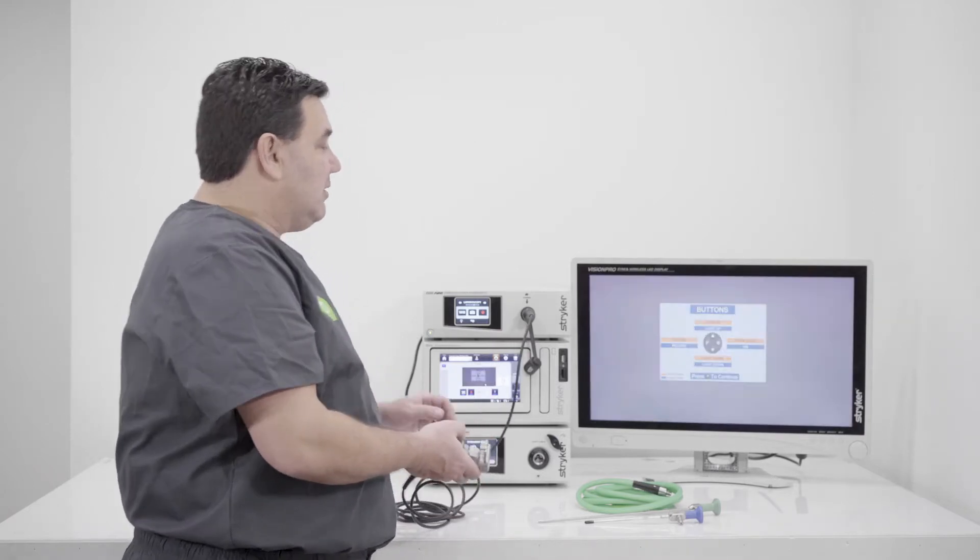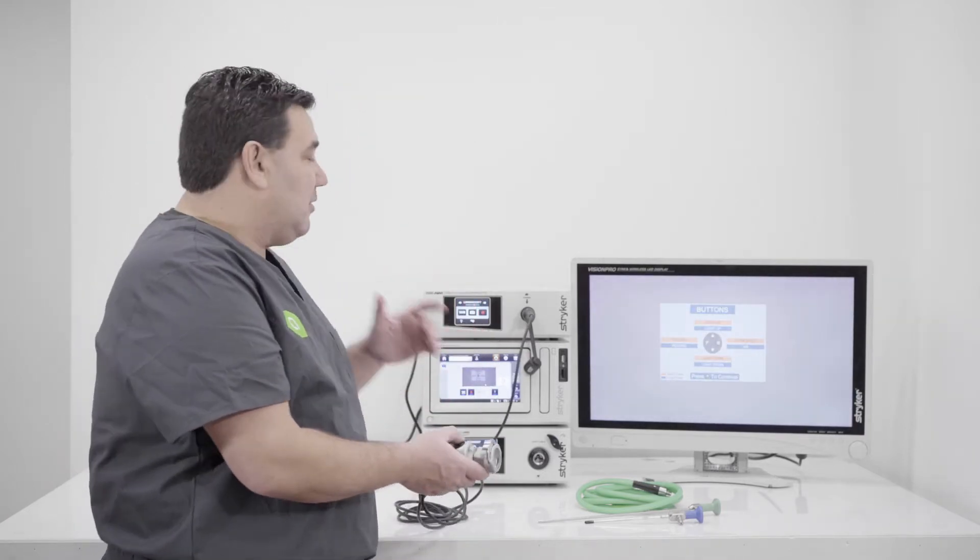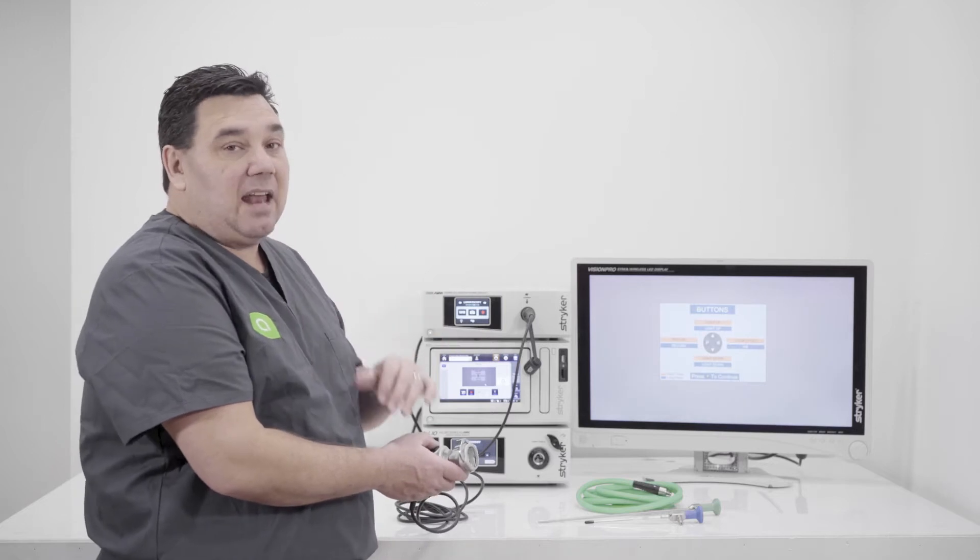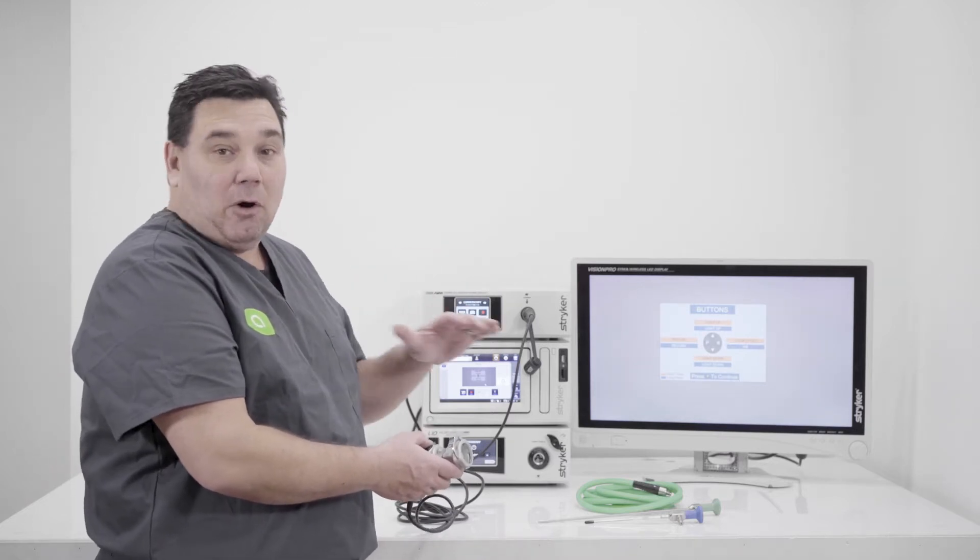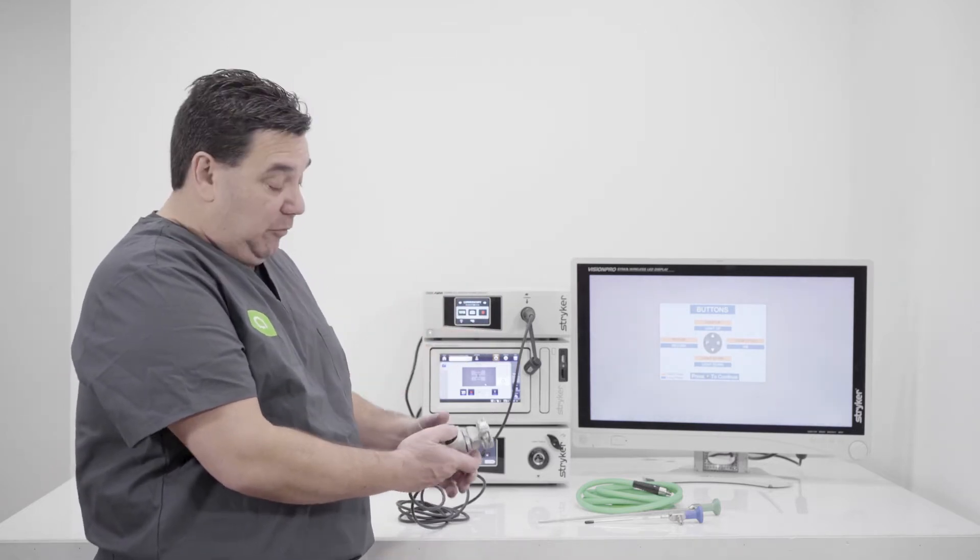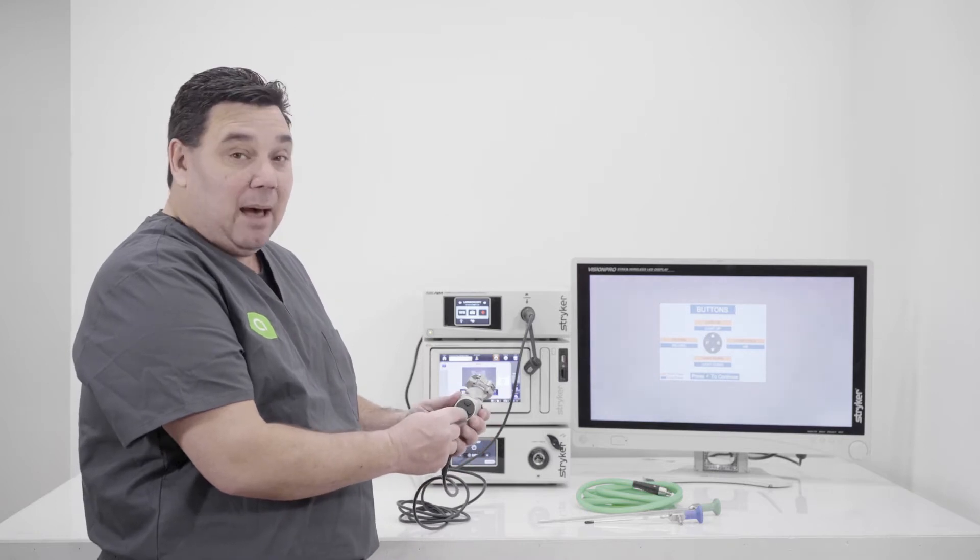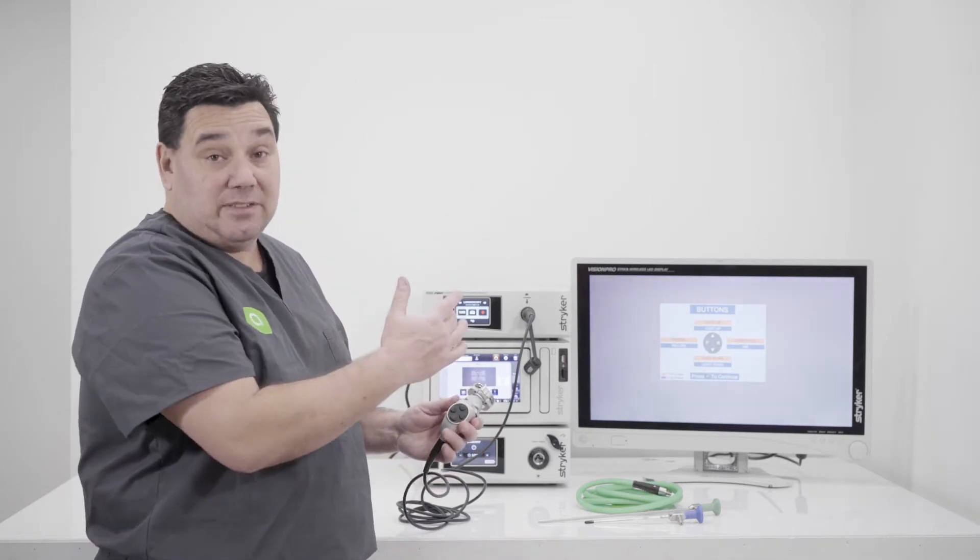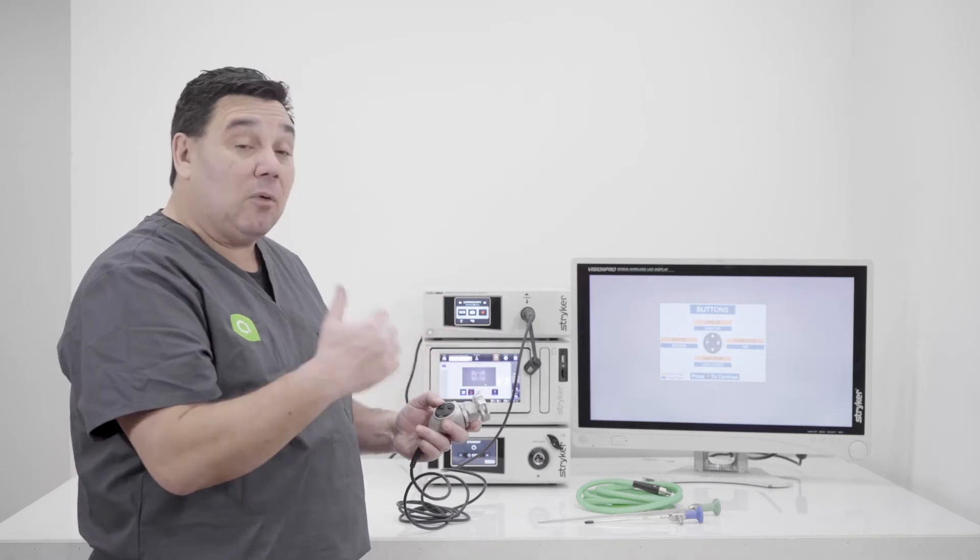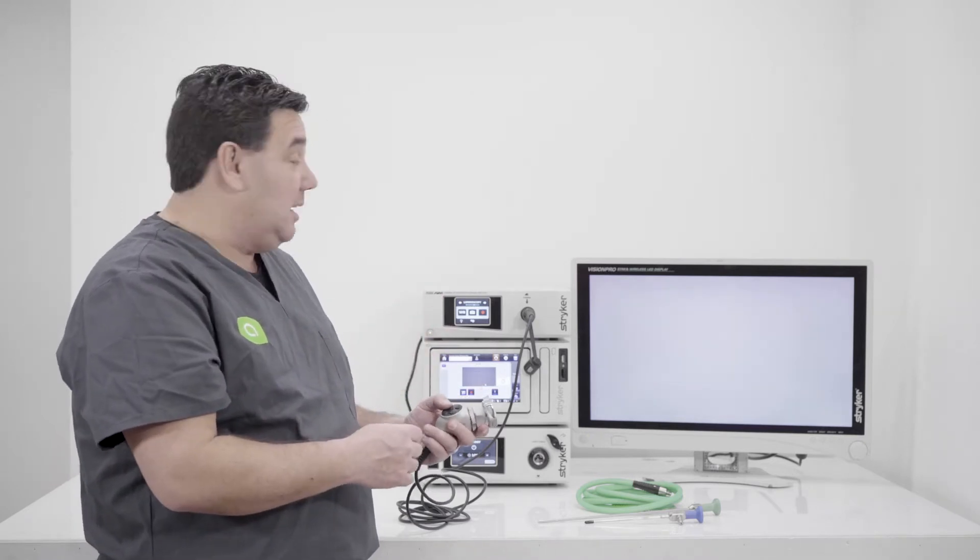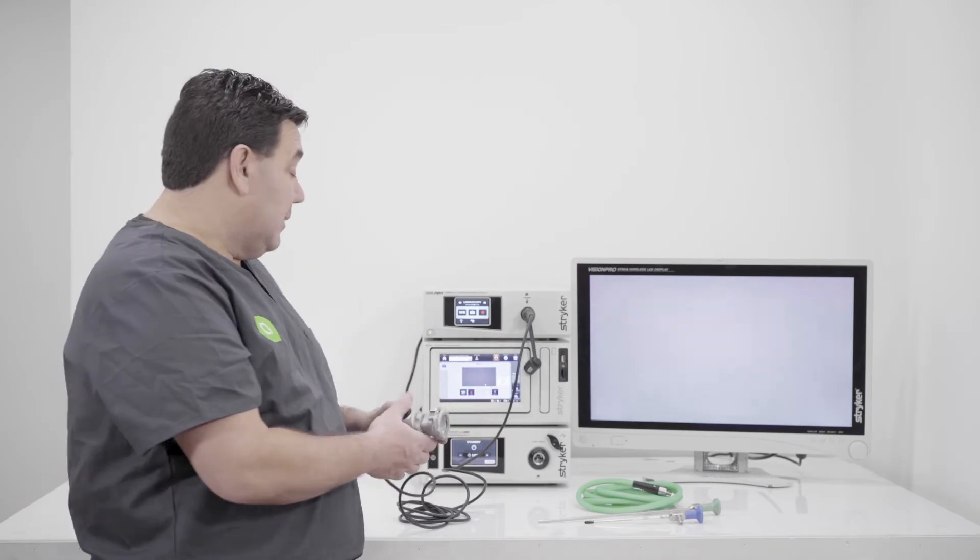And we're going to plug that in. And then when we plug this in, it's going to give us this image. And then it's also going to let us know a few things. It's going to give us the button map function and let us know if we hit these buttons on the top of the camera head, it's going to do these things. So basically to get rid of that, you're just going to hit the P like you're taking a picture and it's going to go away.